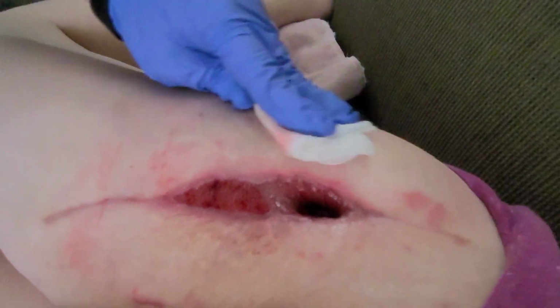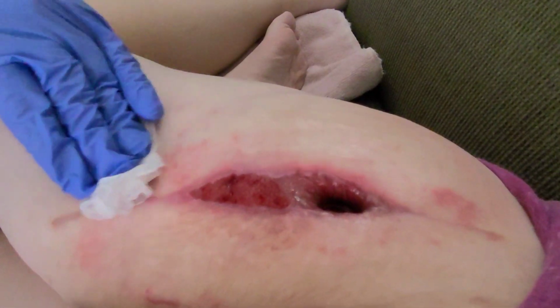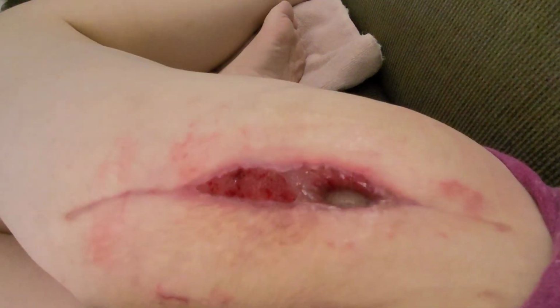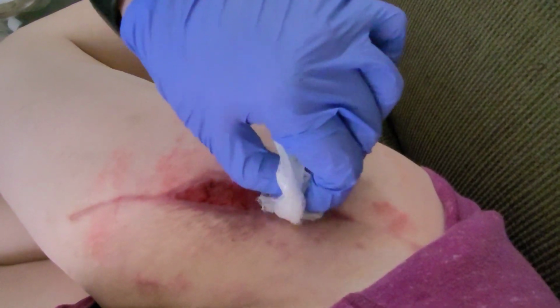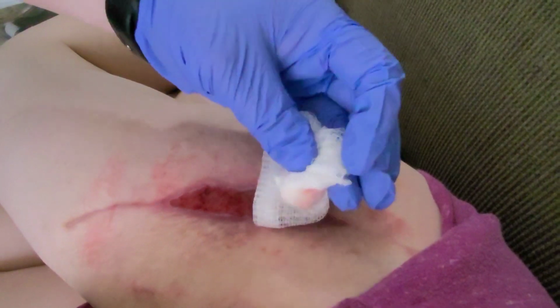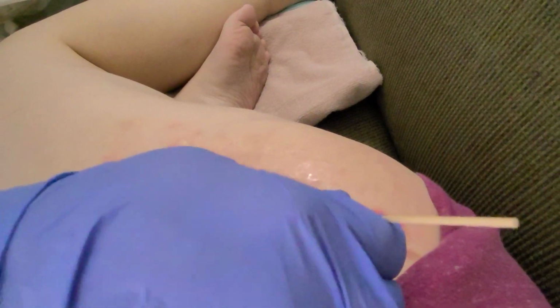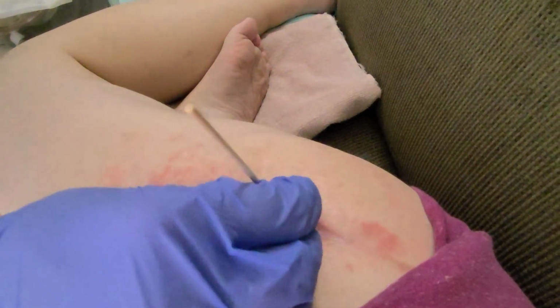After taking the old dressing off, of course, she starts out by cleaning the entire area really well, all the way around the wound. And of course, she's got to get in there and clean the wound itself. But it does not hurt nearly as bad as it might seem. We have to do this to prevent infection. She also has to use these long Q-tip looking things to get really down in there and make sure everything is cleaned out. We don't want any part of that foam left in the wound, because that can also cause infection.